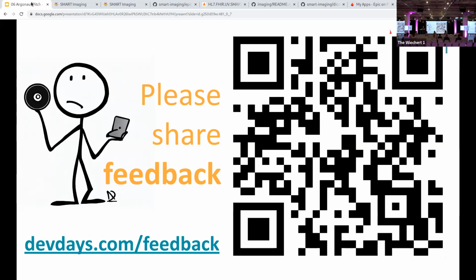I think it's something we could look at. Frankly, there are two flavors of the asynchronous request pattern. The one that we would need here was introduced in R5, and we've been really focused on R4-based implementations for our demos. That's a partial answer. The other is we wanted to keep the simple case simple. So we might change this over time. I don't think we're super committed to one approach or the other, but this was just the easiest thing to document.